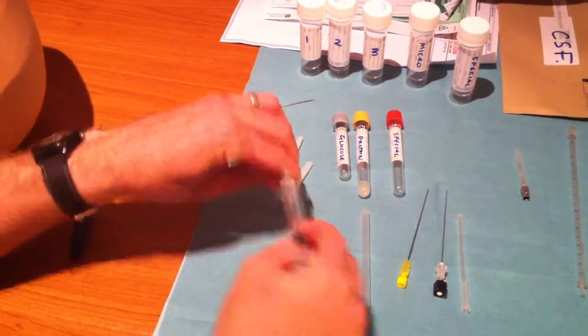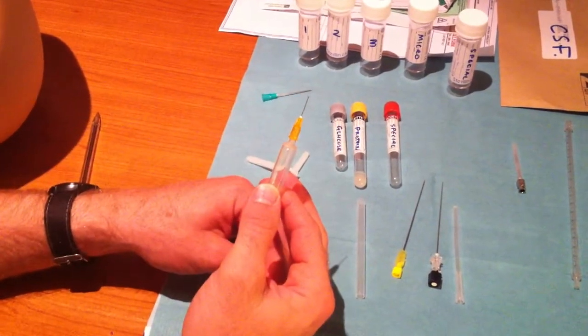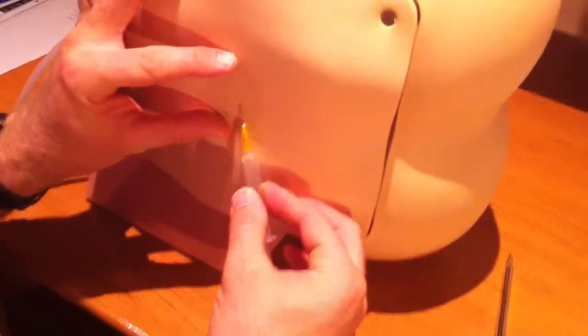You'll then need a shorter needle to produce your subdermal bleb. A subdermal bleb is a way of rapidly anaesthetising the skin.